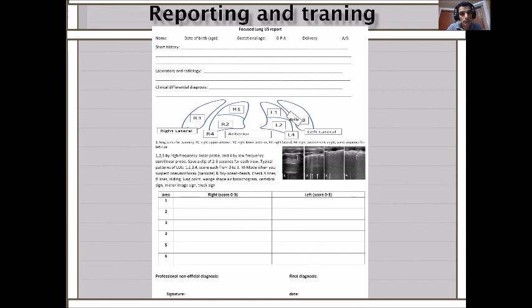Regarding the history lab, do you want us to pick our own cases? Yes. From one day to 17 years old. I don't go above 17 because I'm not an adult physician. I go up to 17, 18, I'm not allowed to touch. But any baby, any child, any young or older adolescent, from one day to 17, you are free to do that. After 17 years, I cannot. But you give me a short history, say a 5-year-old known case of asthma, presenting with this. And then you do 1, 2, 3, and 4. Don't do the back. You only do the vertical.